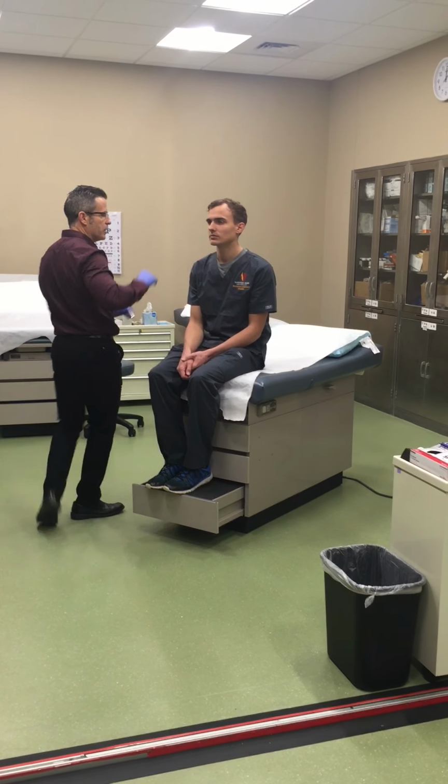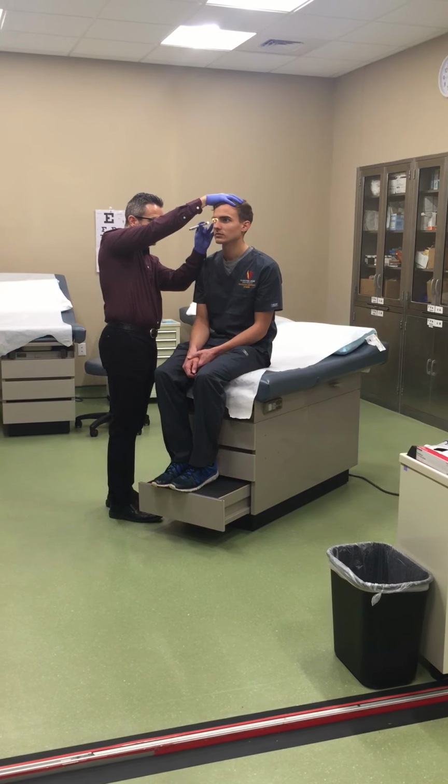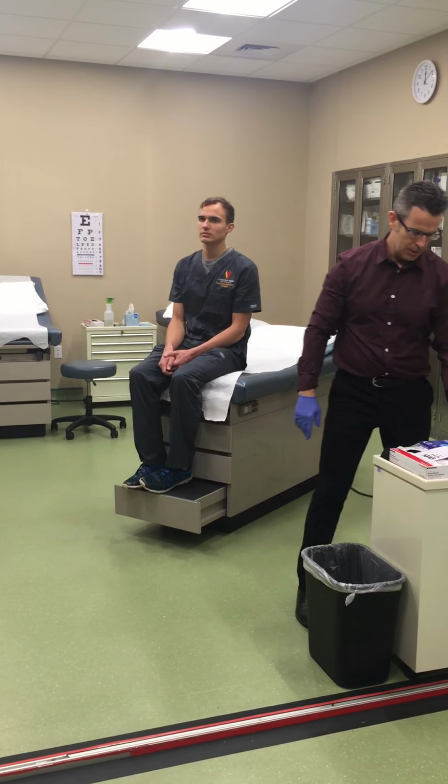And you need to come over here to the other side. Same thing. It's just that tangential lighting is shining, and I can see a really smooth surface to the cornea. That's all we're looking for, okay?